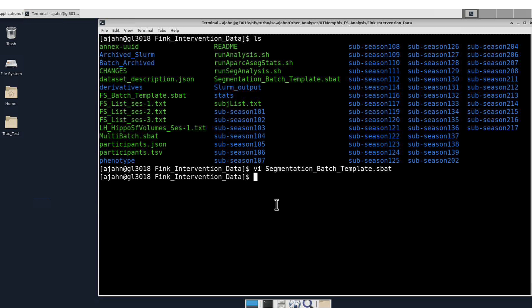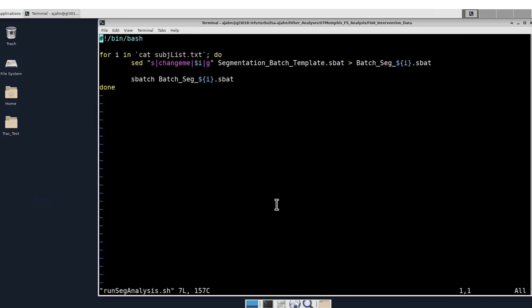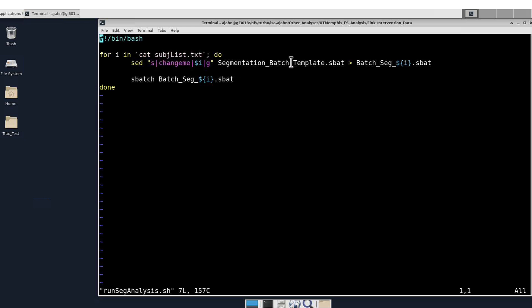I then have another script called runSegAnalysis, which I'll open up in the vi editor, which uses sed to change that variable changeMe and replace them with a list of all the subject IDs that I have in a file called subjectlist.txt.